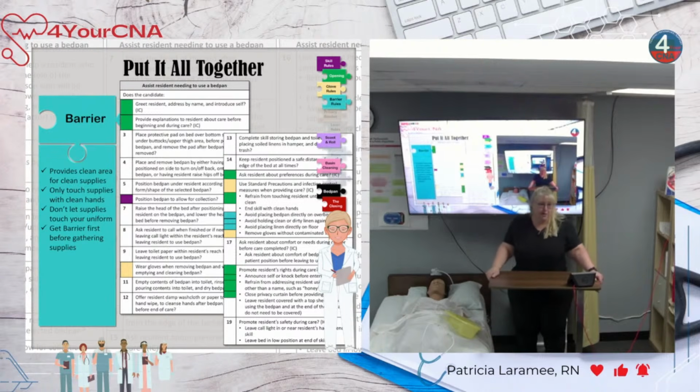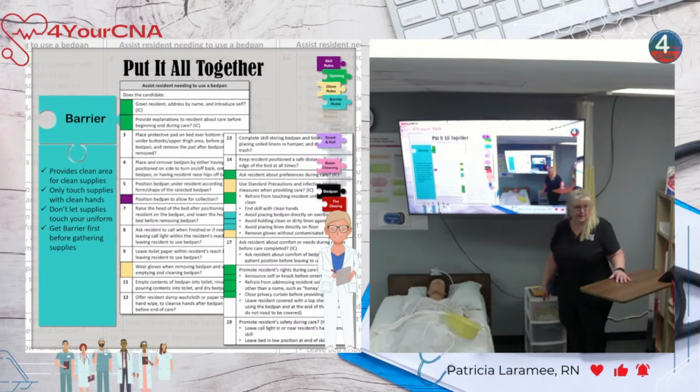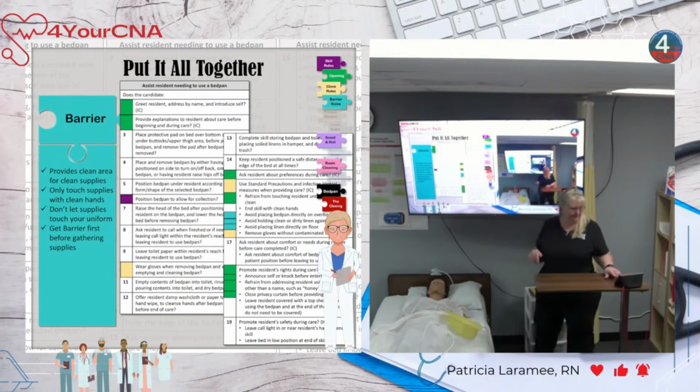But I'm going to tell you, in a clinical setting, if you watch my older videos, you can see this. In a clinical setting, you don't have to pull that bedpan out until right before you're going to put it under their butt. So you can put a barrier on the table and put the hand wipes there, put the gloves there. That's all fine. But I'm leaving that bedpan right where it lives until I'm ready to pop it under their butt. That way I'm not putting the bedpan on an eating surface. It's not a graded checkpoint. If you put the bedpan up here, it's fine as long as there's a barrier. They're okay with it. I'm not. You guys get the difference there? Okay. So to me, that's just kind of a gross thing.